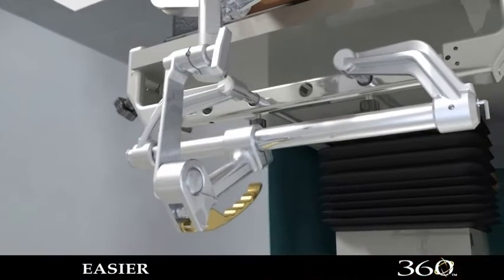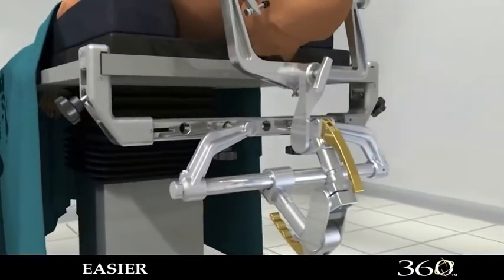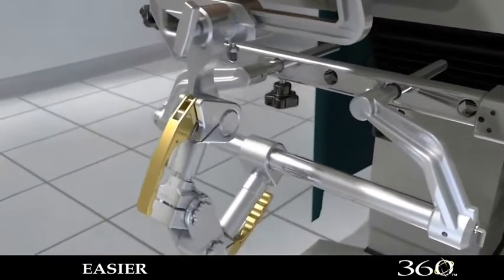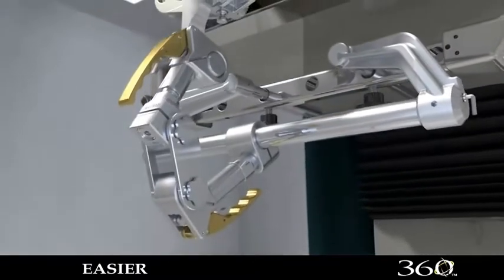Listening to the requests of neurosurgeons, Integra engineers went to work to make the setup and movement of the equipment easier and with more degrees of freedom, to better meet the various requirements of patient positions necessary for today's procedures.